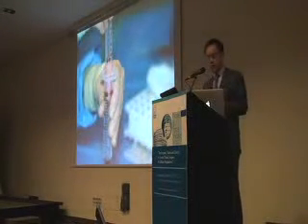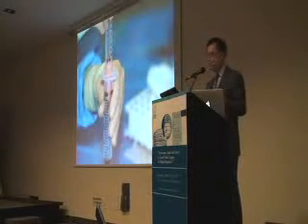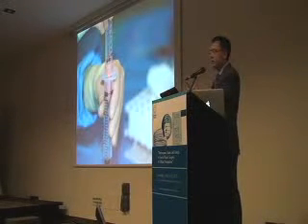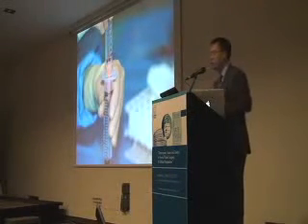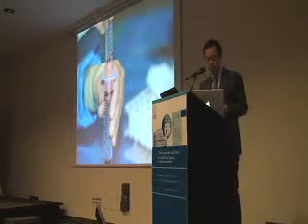And then you want to transfer over all these 10 cc's into a 25 cc syringe. One thing that is important is to look at your harvest as you're harvesting. I typically get about 50%. In other words, if I'm going to pull a 10 cc syringe out, I'll get 5 cc's of usable fat. But clearly, if it's a bloody harvest and you're having a hard time, you're going to have to plan that you're only going to get 2 cc's out of that 10 cc's. You're going to have to harvest more to get what you want. Spin the first couple syringes, see if you're getting the yields. If you're not, you'll need more.